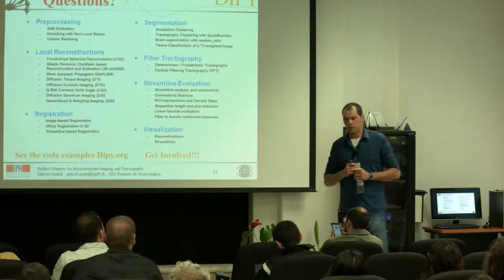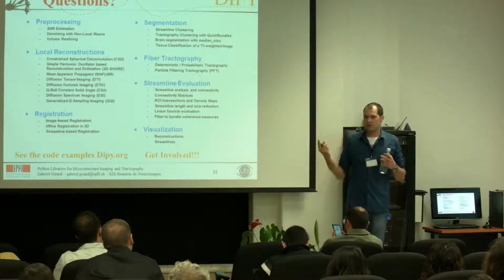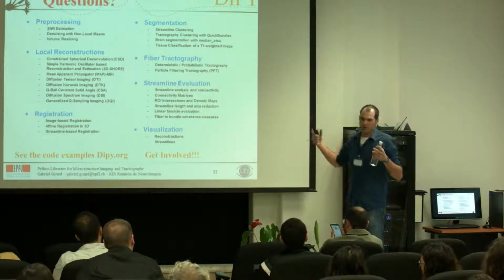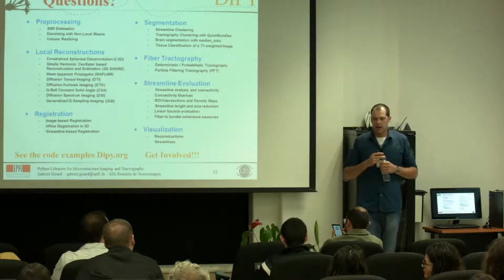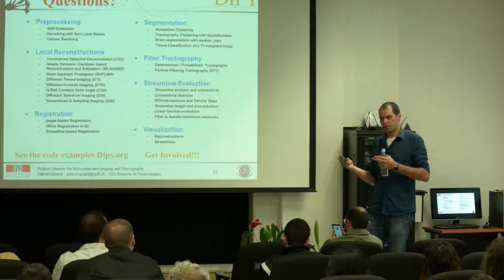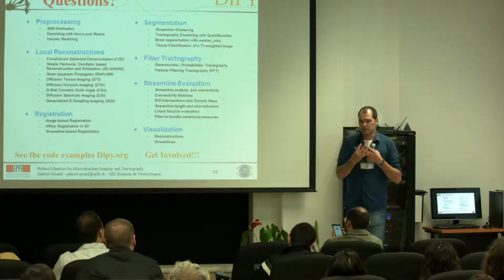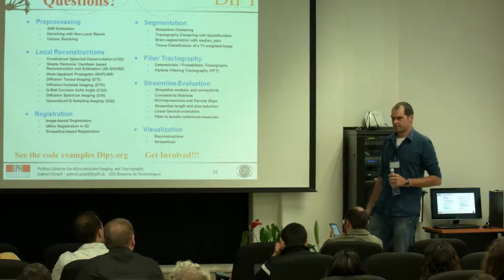No, but I mean, if you use the diffusion images, it doesn't matter which space or which voxel size you have, it essentially works with the 3D or the 4D matrix of the data. If you want to, for instance, have the T1 information on top of your diffusion images, then you need to be sure that the images are registered. So either spatially registered or the same resolution, but you need to be sure that the data are spatially coherent.